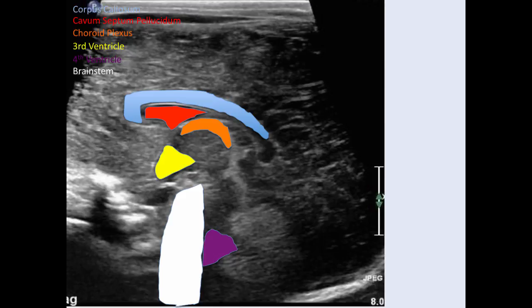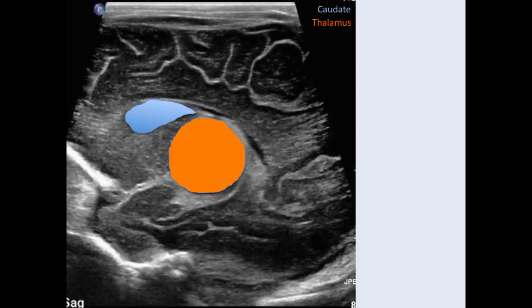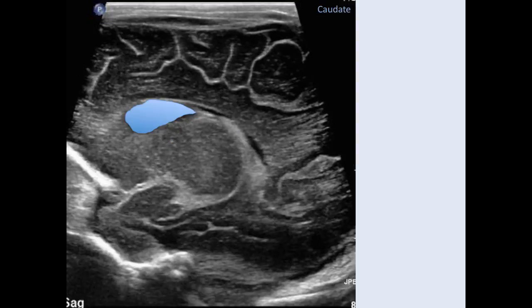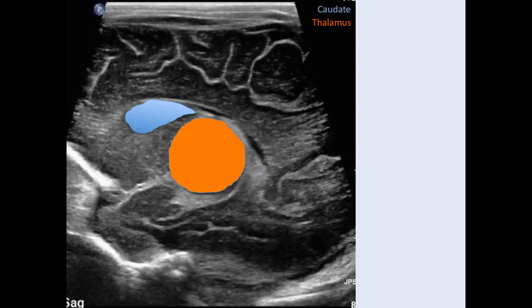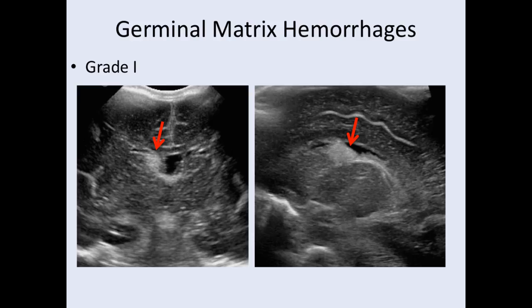Now we're off parasagittal or off midline to one side. This is the important image where we see our caudothalamic groove, which is the prime area for assessing germinal matrix hemorrhages. Two important structures on this image: you have your caudate nucleus here and your thalamus here, and the little indentation or divot between the two is the caudothalamic groove. That is the area we're focused on the most when looking for germinal matrix hemorrhages.